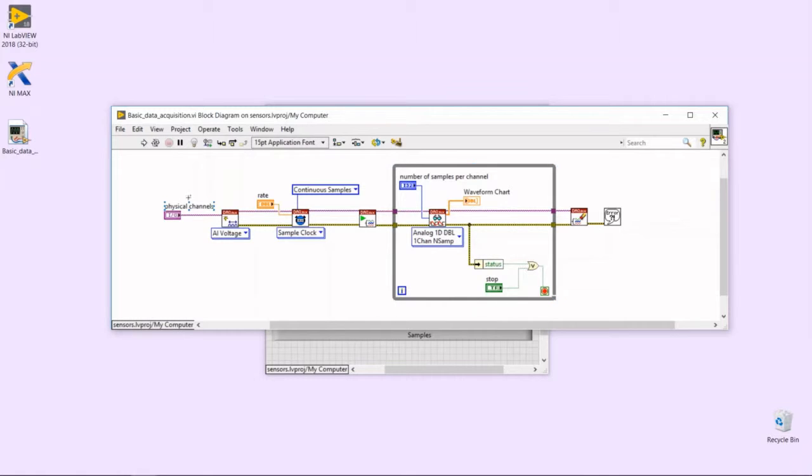We already went through what physical channel means, rate of the acquisition, and the difference between continuous and finite samples during the acquisition. We said finite samples means that acquisition is going to last a finite number of samples that we set, and continuous samples means that acquisition is going to last until the program is stopped. Okay, so we're going to choose continuous samples. We have to add some more inputs to this create channel block, because we are going to measure signals from the real AD card, not the simulated one.